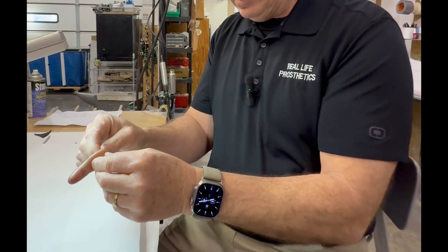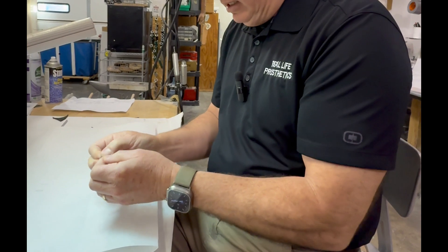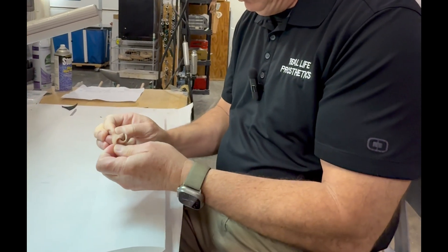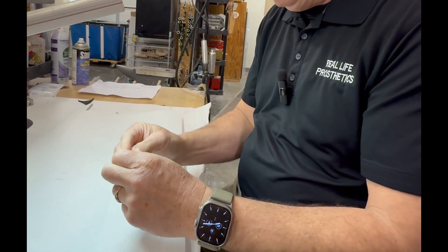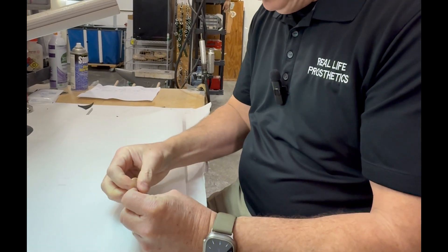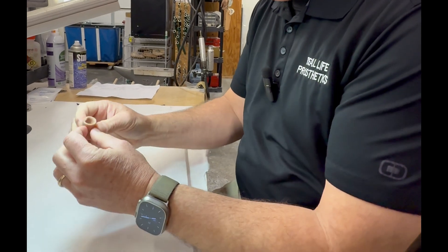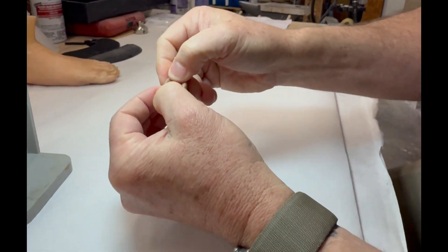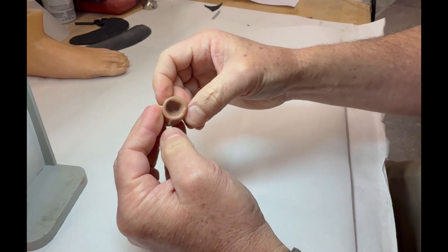Internally within the socket, I'll turn the socket inside out. Silicone does have some cling to it so sometimes it's a little difficult. I can use alcohol at times to help. I take a look deep into the socket — looks like there may be a little bit of separation taking place there as well, so I will touch that up.